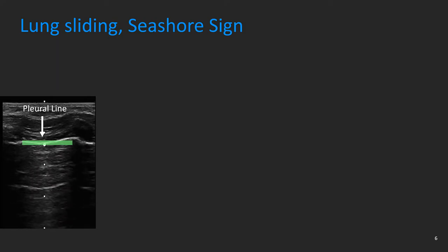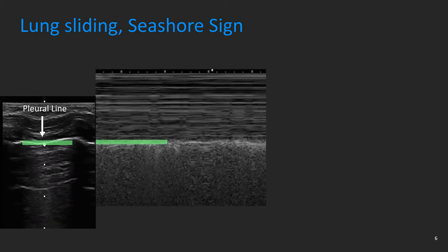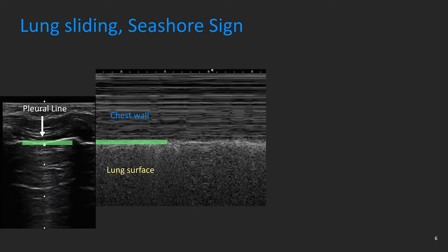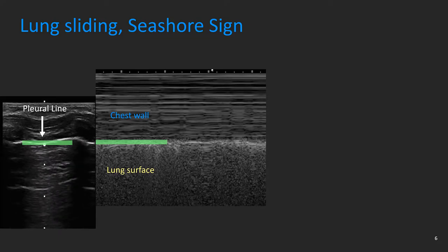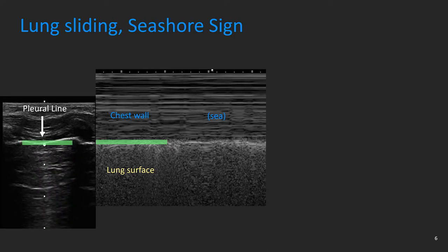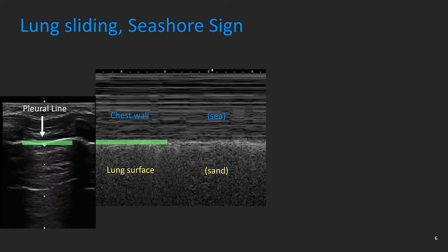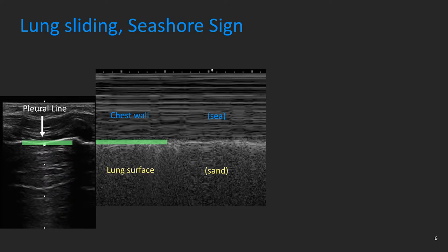Starting with a 2D image of the pleural line, we place the M-mode vector line across and perpendicular to the pleural line, so that it displays the chest wall above the pleural line and the lung surface below. M-mode imaging of a healthy lung in a patient breathing normally is represented by lung sliding or the seashore sign, in which the static chest wall shows a pattern of multiple horizontally straight lines, and the lung surface shows a granular image appearance — the sand on the beach — as a consequence of artifacts generated by the dynamic movement of the sliding lung surface.